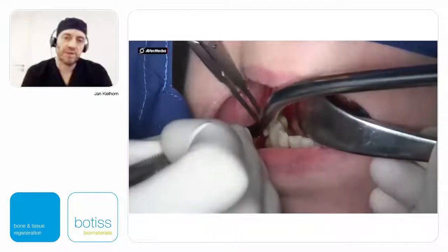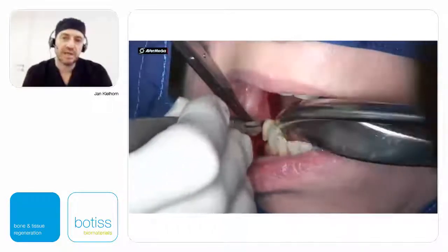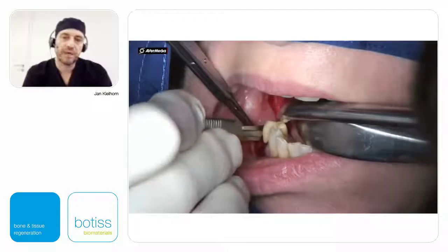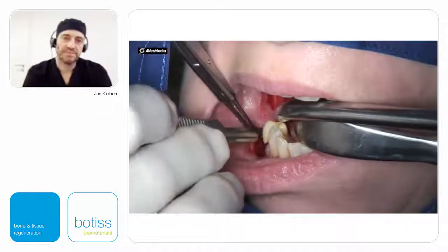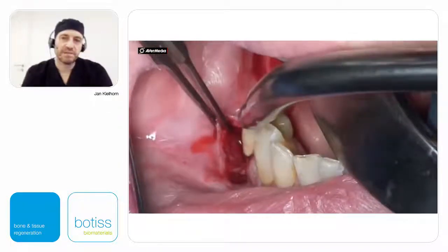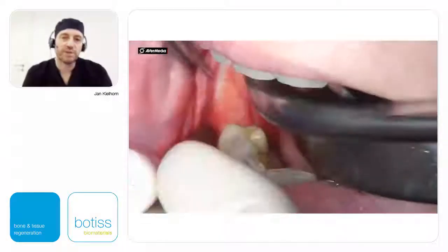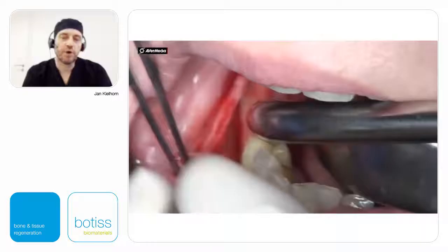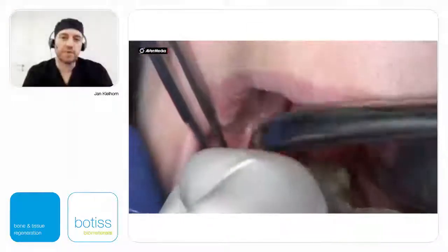That is only because there's a technique that is unknown to colleagues, which is prolonging the lingual flap without a periosteal cut. Most people don't know that you got very weak connective tissue, which is between the lingual mucosa and the muscle on the bottom of the lingual side.